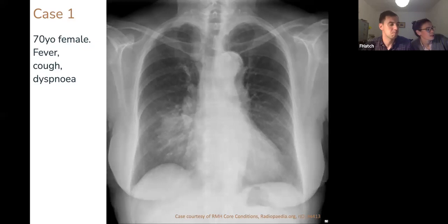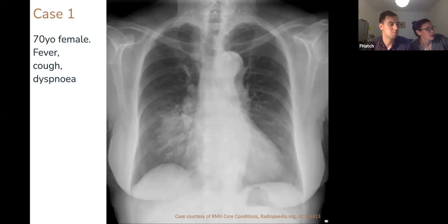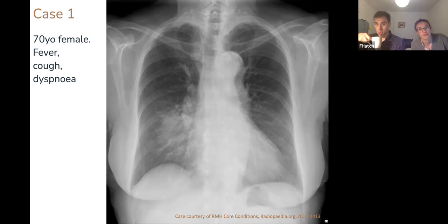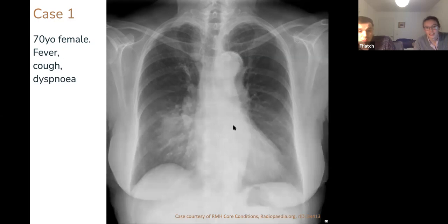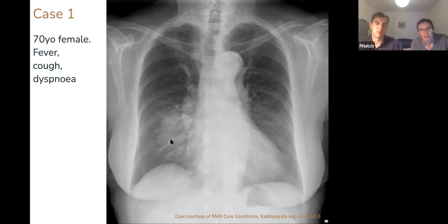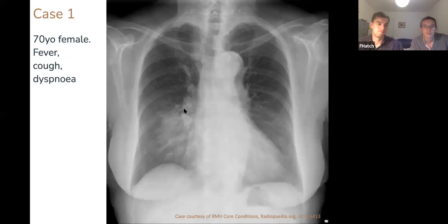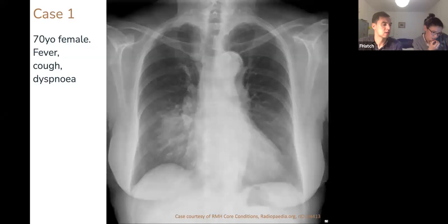The key descriptive term here is 'patchy opacification' — there's no well-defined edge to the whiteness. Given the clinical history of fever, cough, and shortness of breath, and the x-ray evidence of consolidation, you could say this patient has a right middle lobe pneumonia — or more safely, right mid-to-lower zone consolidation, which are all fair and appropriate descriptions.